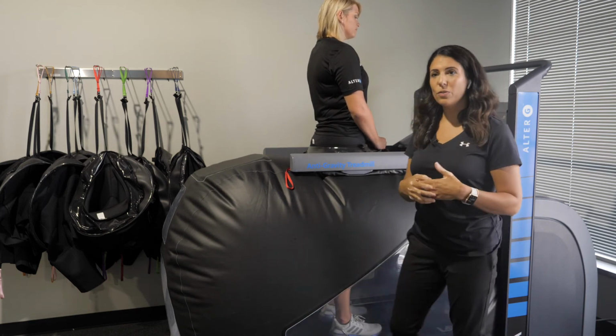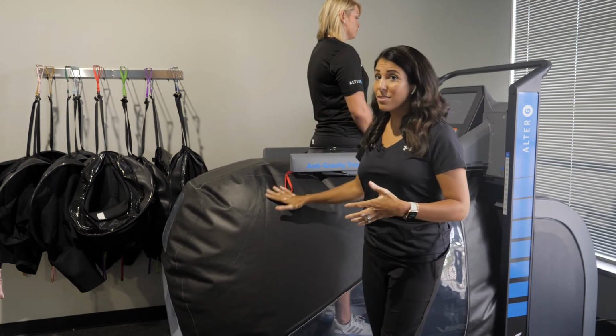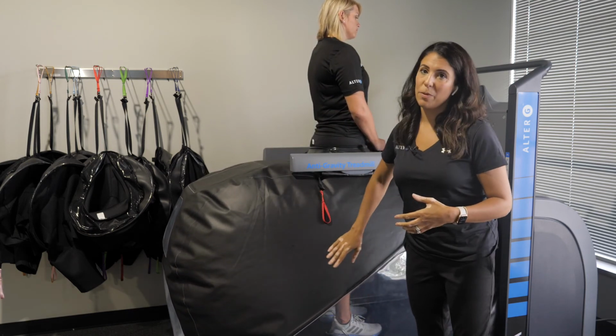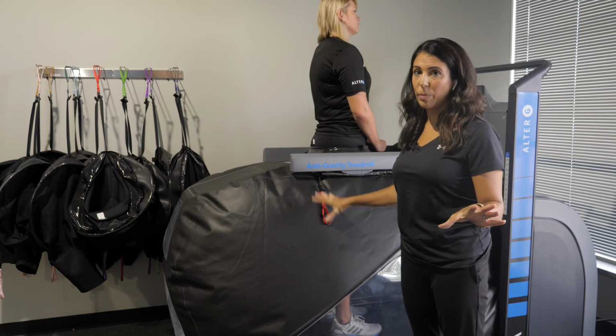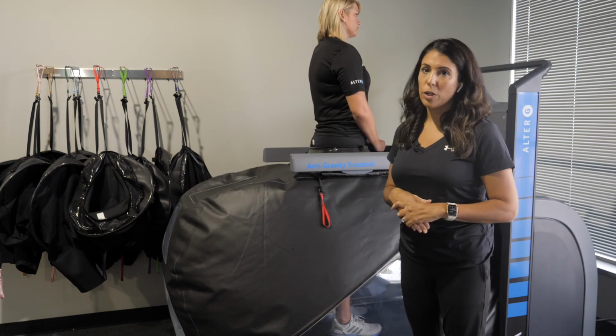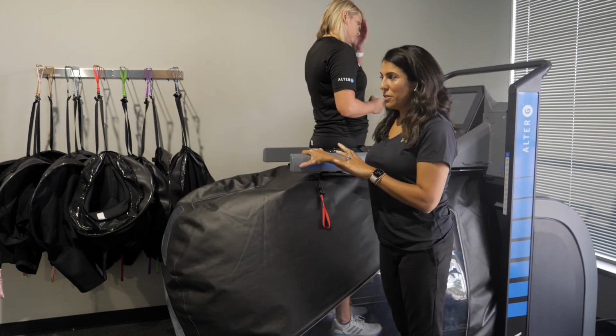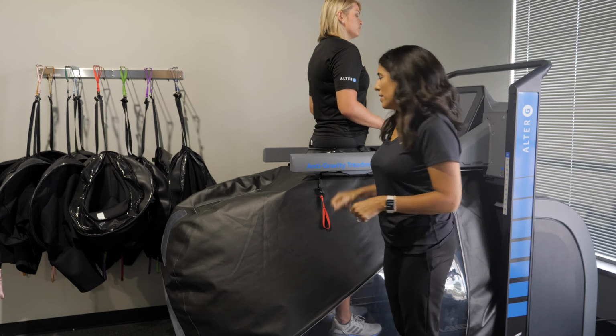So when you're finished with your session, you can simply press stop. When I press stop versus pause, though, it's important to remember that the body weight support will now go back to 100%. You can see the bag starting to deflate, as well as have the treadmill belt stop. So at this point, if your patient is fatigued, make sure that they hold on to the handrail so that they do have that support.